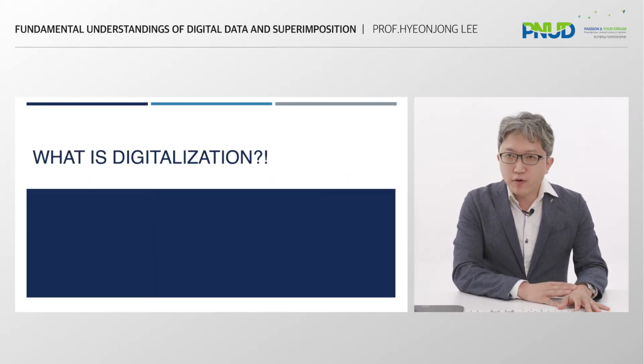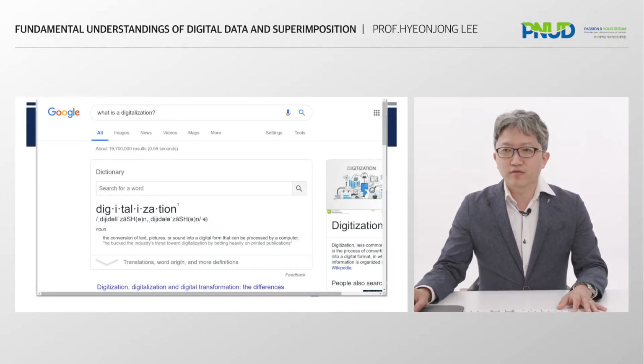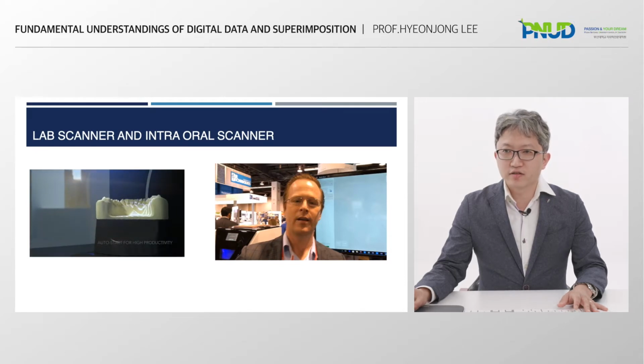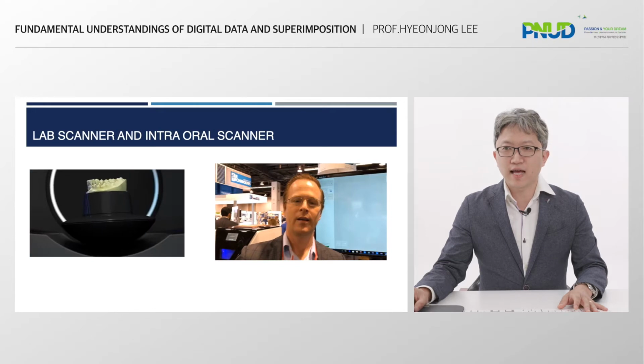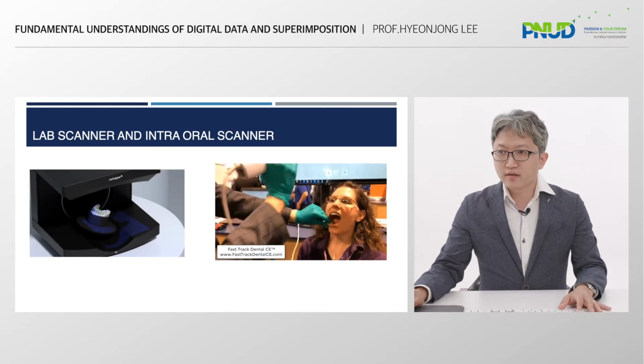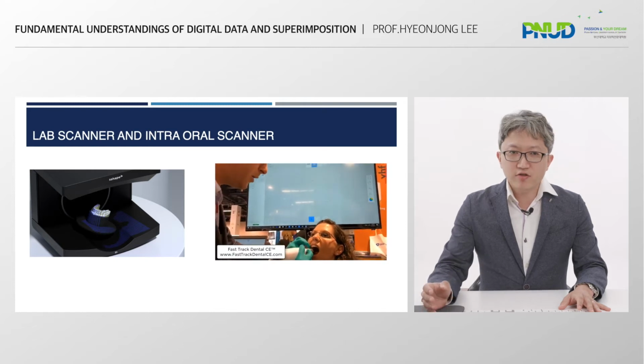So let's think, what is digitalization? We can search it on Google and see that digitalization is the conversion of text, picture, or sound into a digital form that can be processed by a computer. And nowadays, there are really many kinds of 3D devices for 3D digitalization. As you can see, this is the lab scanner to digitize the gypsum model into 3D. And this is the well-known intraoral scanner. And yes, nowadays it's not that difficult.